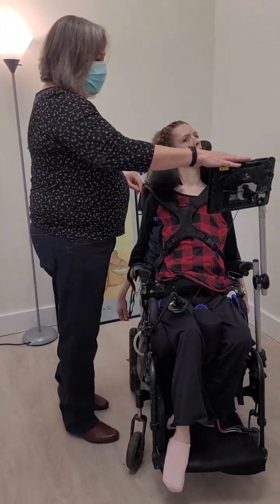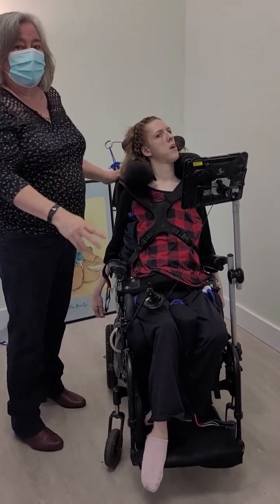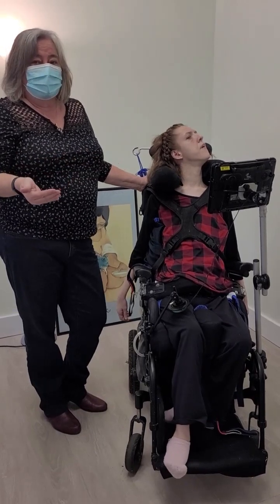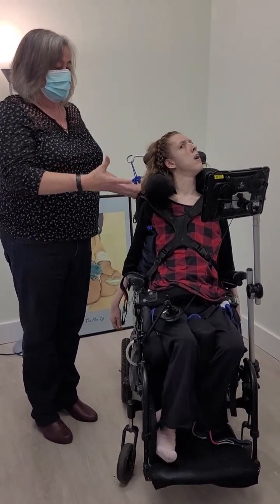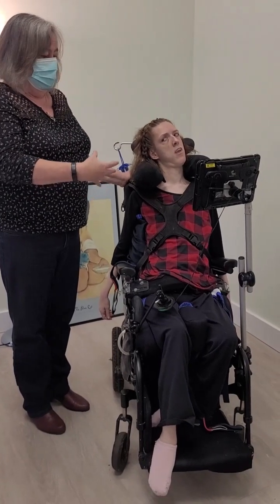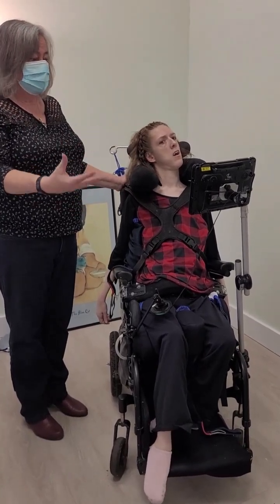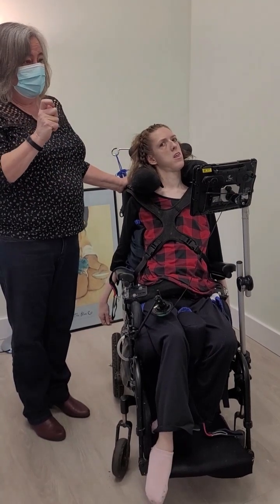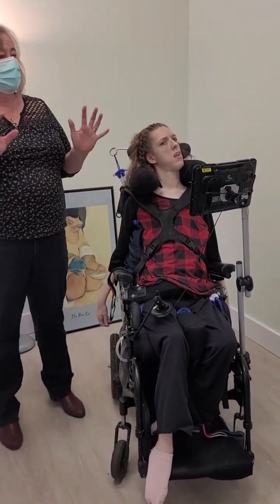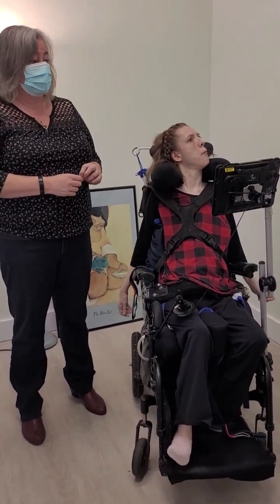The other thing that sometimes happens is the device will freeze when she's trying to use it. If it freezes, usually just holding down the on-off button will do a gentle reset. If it needs more than that, you should note that to tell one of the more regular staff — Dawn Marie and Sam can both troubleshoot a lot of those things. If you have ideas about things that aren't working well, please let them know. You can also clean the device using rubbing alcohol wipes directly on the screen, around it, on the switch, on the cord, and on the mount. They dry quickly and don't do any harm to the device, so just keep everything around Julie as safe as the other things you keep safe.